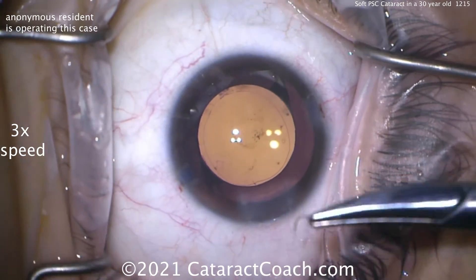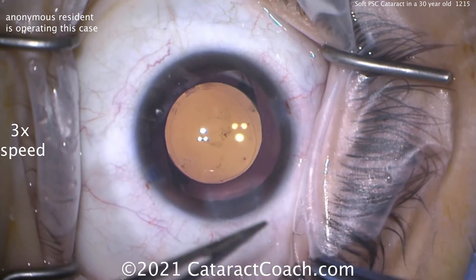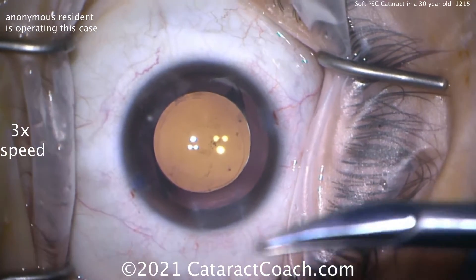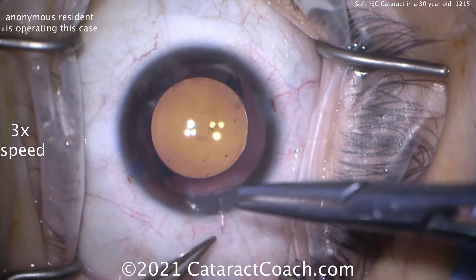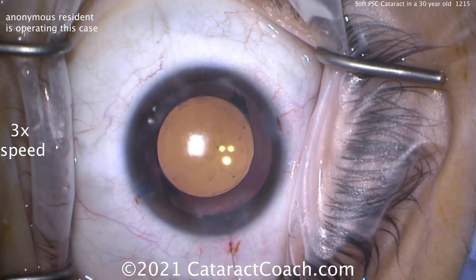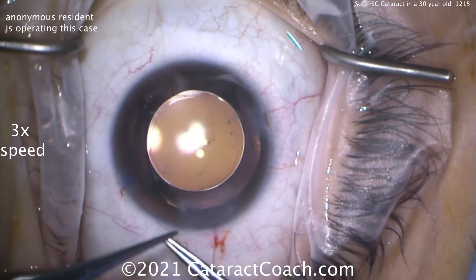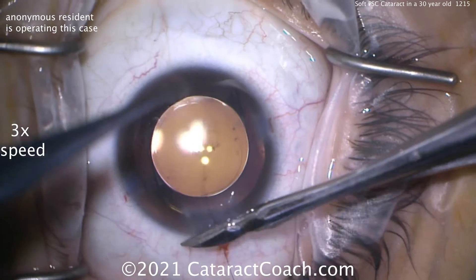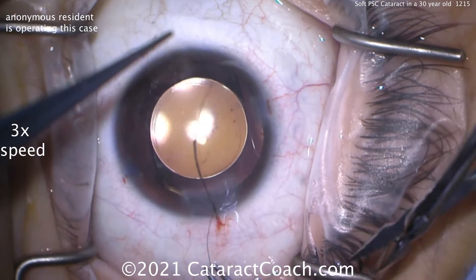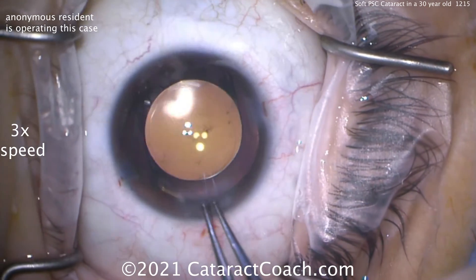And guess what this young patient deserves? A suture. The resident is going to pass a 10-0 nylon suture. The ability to suture with 10-0 nylon must be practiced before you come to the operating room. You can practice in the wet lab — just use the surgical microscope and suture a tomato skin or a grape skin. You have to have your hands used to working under the microscope with 10-0 nylon. No one was born knowing how to suture with 10-0 nylon — it has to be practiced. If you're a basketball fan, this is the equivalent of your free throw: you must be able to shoot 90% from the free throw line before you come to the big game. This resident did a nice job — that's a pretty good suture. Nicely done. I encourage you to do the same.